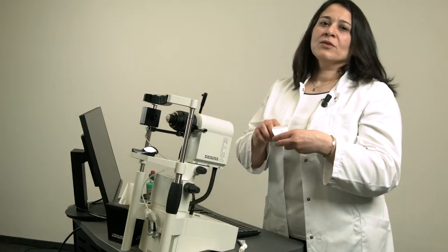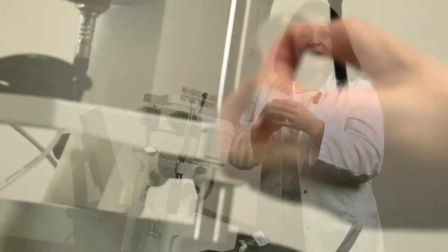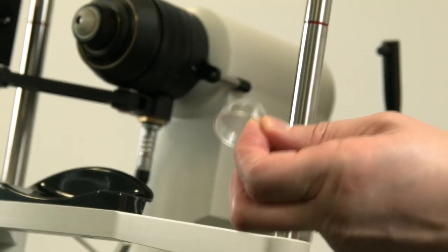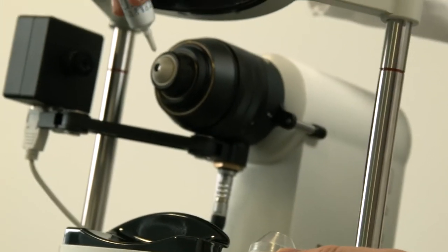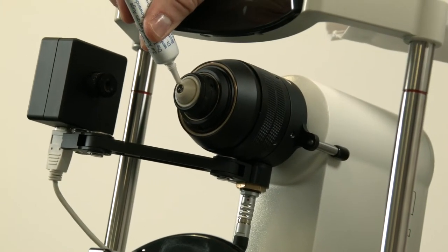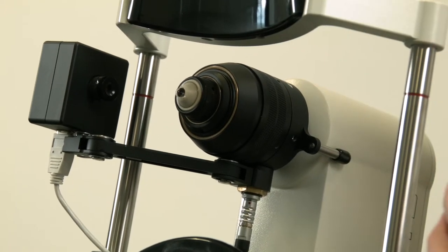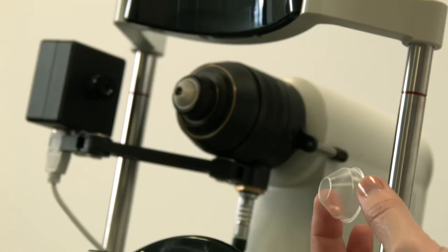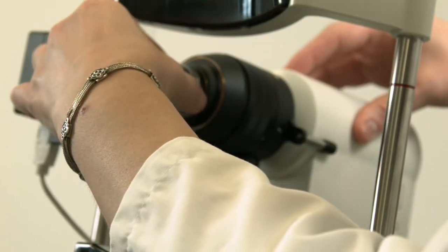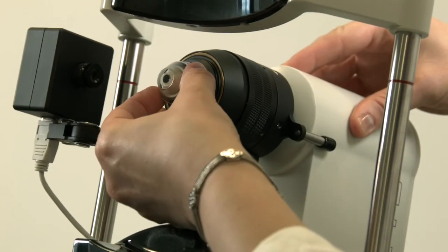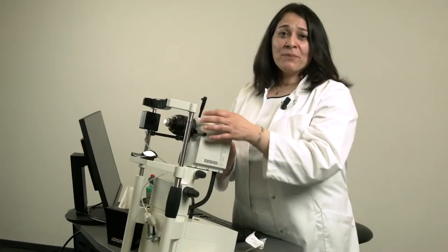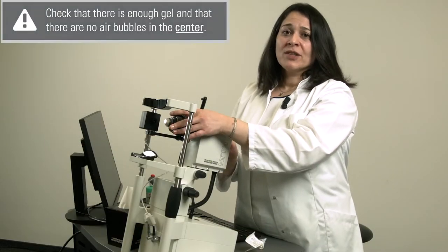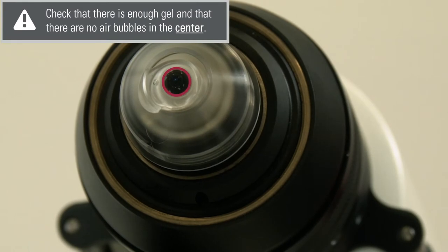To place the tomo cap on the objective of the RCM, remove it from the package and take care not to touch the front surface. A highly viscous gel serves as a gel bridge between the objective and the tomo cap. Apply an adequate amount of gel to the front surface of the objective and firmly attach the tomo cap without touching the front surface. Then check that there is enough gel and that there are no air bubbles in the center.